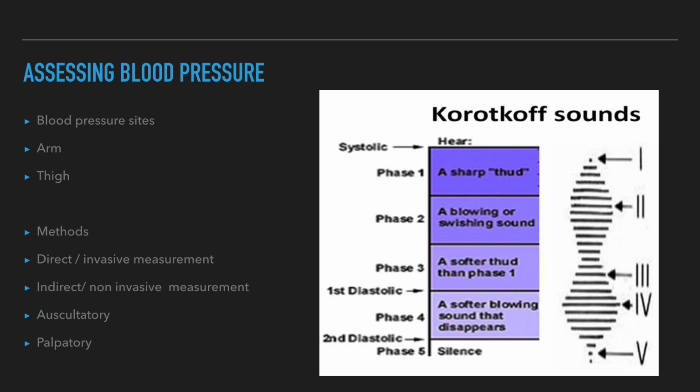Sites. Blood pressure can be measured in either the upper or lower extremity. Upper extremity. The blood pressure usually is measured in the arm. Wrap a cuff around the upper part of the limb and auscultate or palpate blood flow at the brachial artery. Blood pressure also may be determined by auscultation or palpation of the radial artery in the wrist with an appropriately sized cuff applied to the forearm. Blood pressure readings will differ when measured in the upper and lower arm, so it is important to note the site of blood pressure measurement.